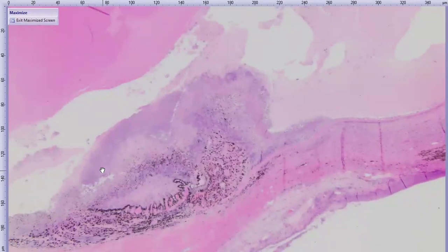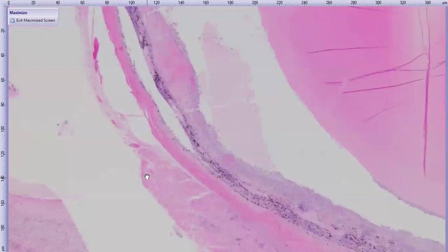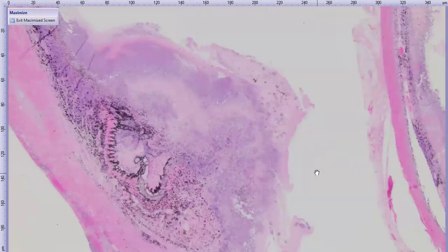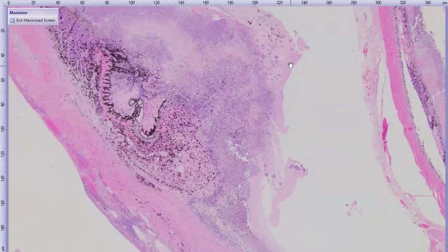See a similar sort of carpet here. It's a very fuzzy looking iris and ciliary body. And in this case, the carpet is also extending onto the epichoroidal surface. And we can't really make out much of a retina. We'll look closer. There's a slight stubbing here that's somewhat recognizable, but mostly the retina is pretty necrotic and detached. From low magnification, we can see these lovely asteroid bodies, which we'll take a look at closer. And we can also see this pink halo near this carpety area, and we'll take a look at that closer too.